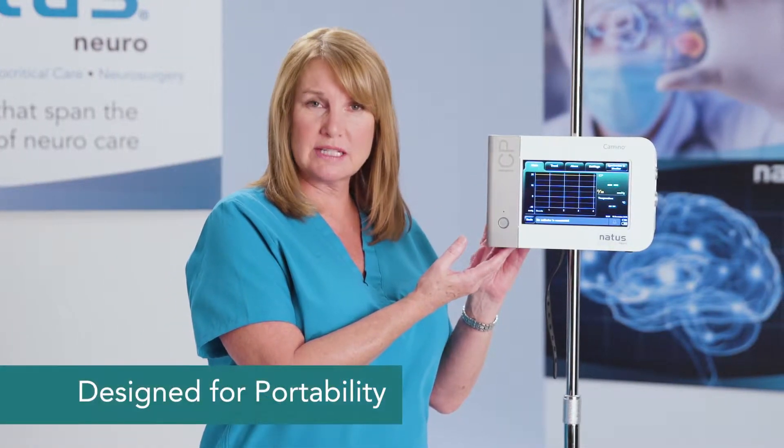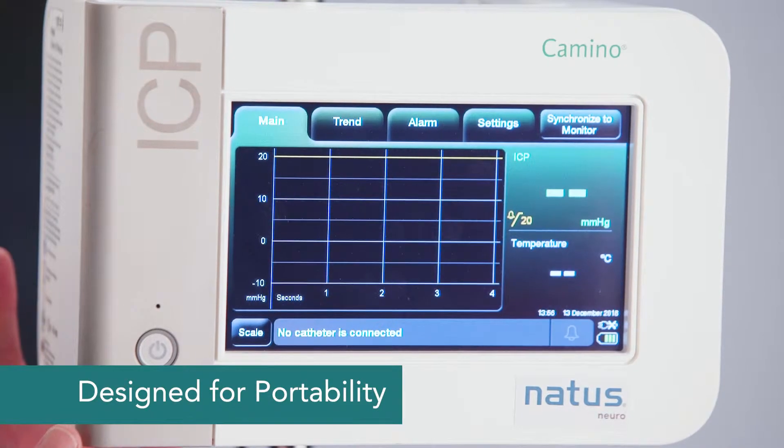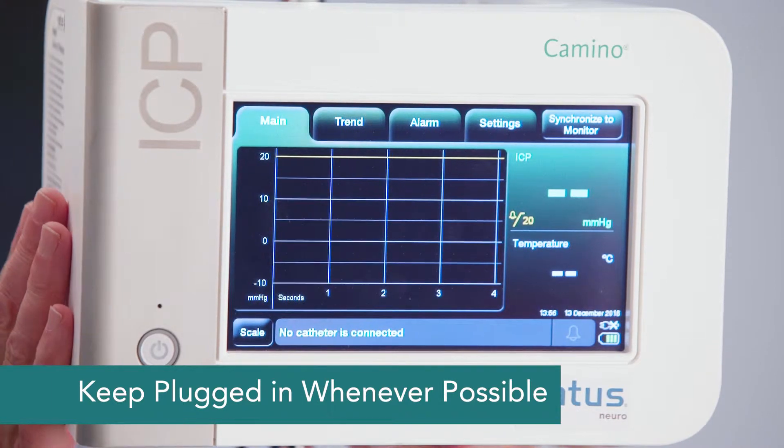Let's do an overview of the Camino ICP monitor. The monitor itself only weighs about six and a half pounds — it's lightweight and meant to be traveled with. Because it has a battery, we prefer that it stay plugged in all the time to keep that battery charged.